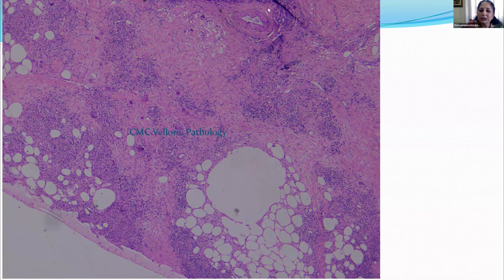So just having perivascular infiltrate is not enough to call it vasculitis. You have to have transmural inflammation with, if it's a small vessel, either endothelial cell necrosis or fibrinoid necrosis or karyorrhectic debris. Here, I am not seeing vasculitis, maybe a vasculopathic change because it's some perivascular infiltrates. I can see some giant cells here. Can you see that? What about the necrosis? What sort of necrosis do you see?